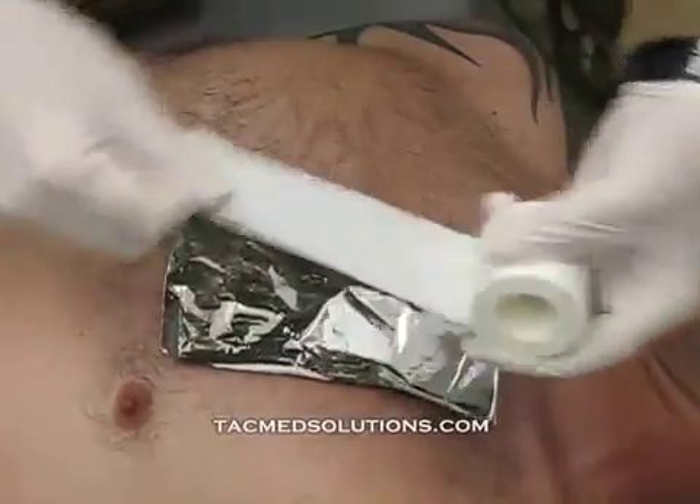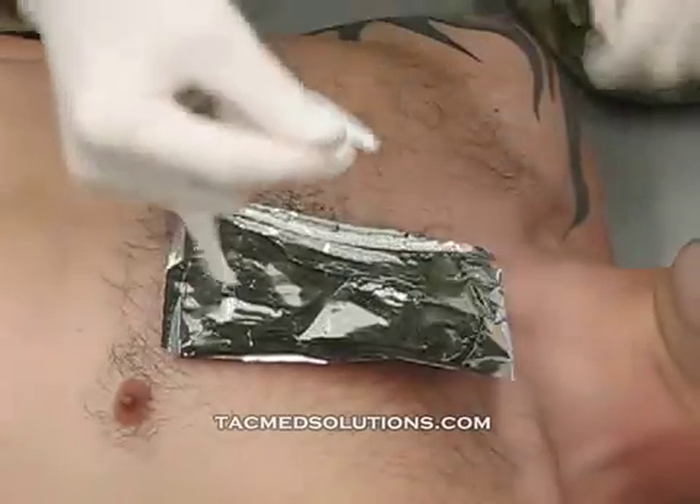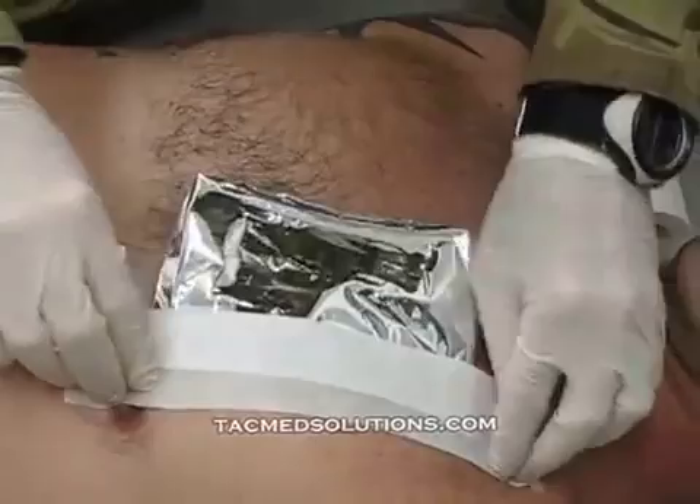Use tape to secure three sides of the bandage to the casualty's chest. The three-sided occlusive allows pressure to escape the chest cavity, preventing the onset of a tension pneumothorax.